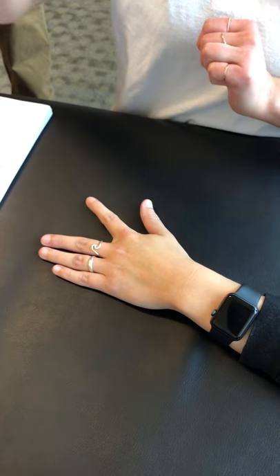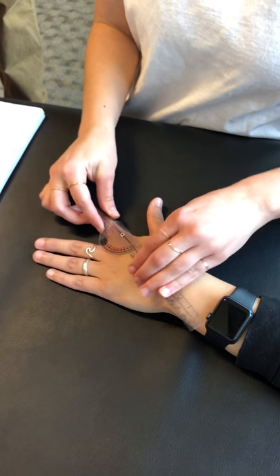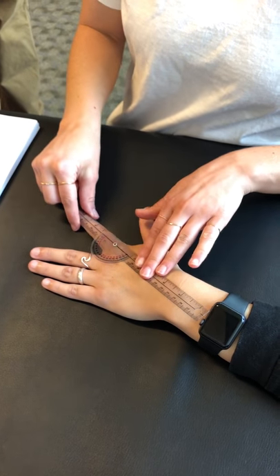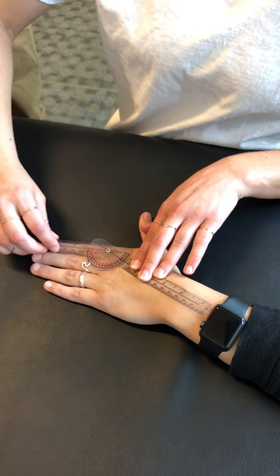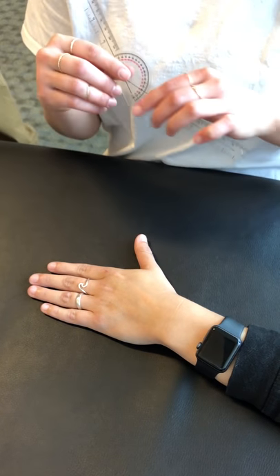She's at about 22 degrees. For adduction, you'll do the same thing — line it up right there, all the way in the middle of the finger. Then she's going to bring her finger in and you'll line that up. The range is 0 to 20 as well, and that is a firm end-feel.